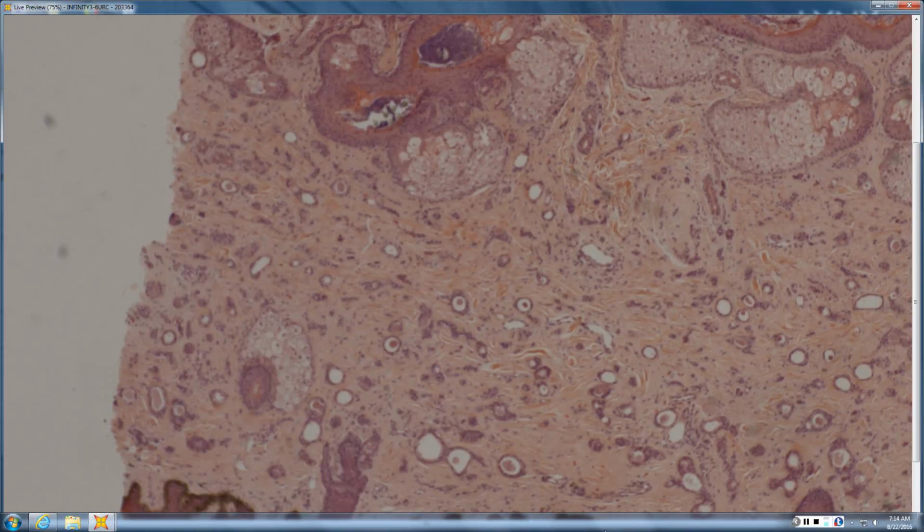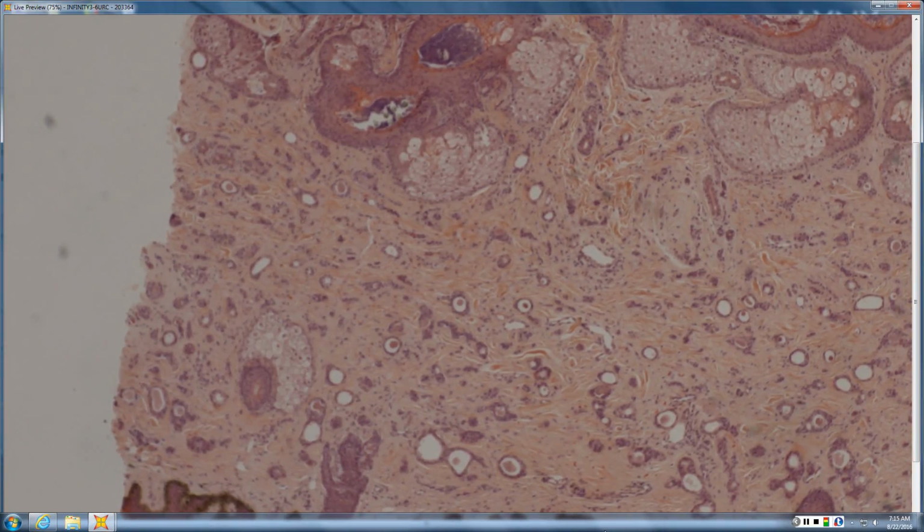So unlike in unpigmented skin, you're like, oh, maybe it's just a syringoma. But you'd want it to be a small little proliferation with really dense red sclerotic stroma, which you don't necessarily see here. And so this could be any of those things. Now it's not super deep. You don't have lymphoid aggregate, so it's probably not a MAC. But you'd have to go through that differential, which is why the answer for this one is really just differential. Use all your clues to get to the bottom of that one.